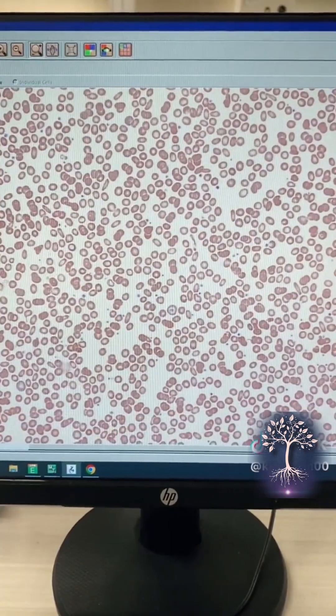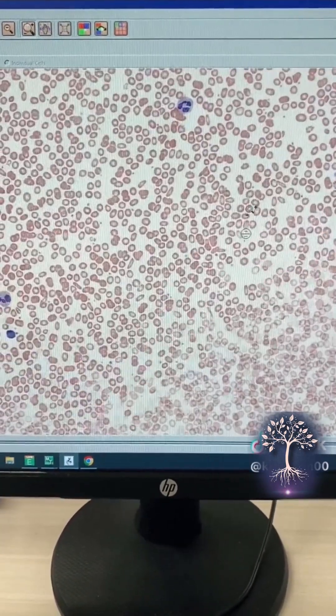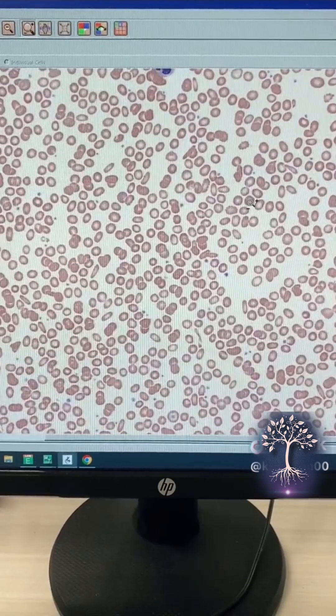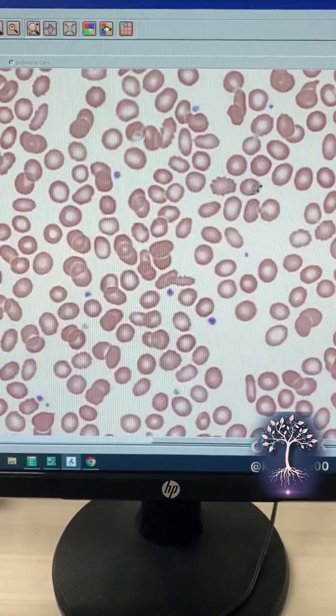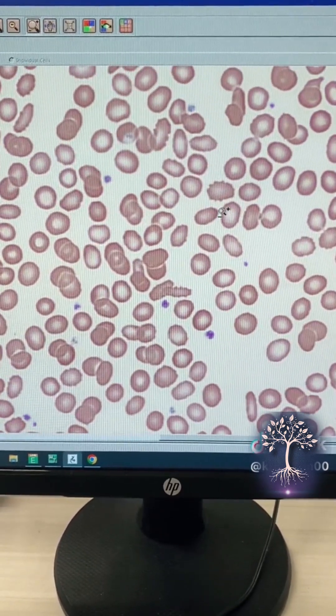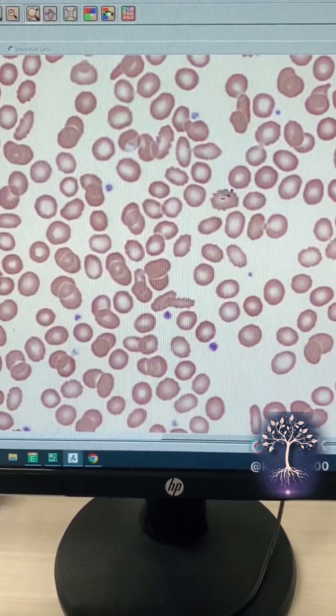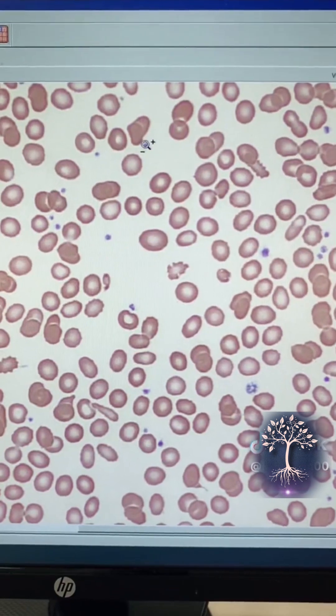Not only does the CellaVision transmit your white blood cells but it also shows us your red blood cells and your platelets.